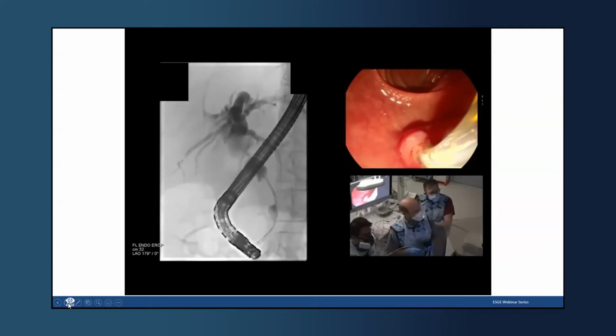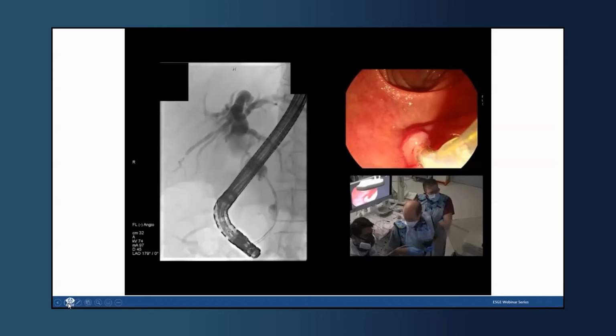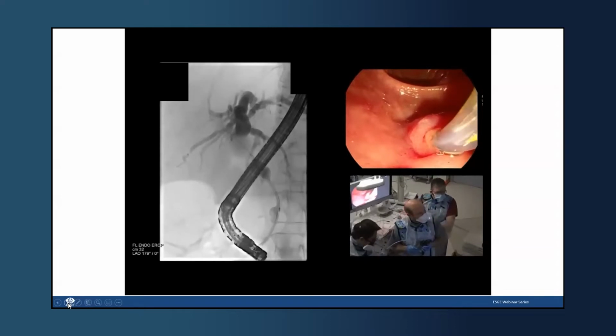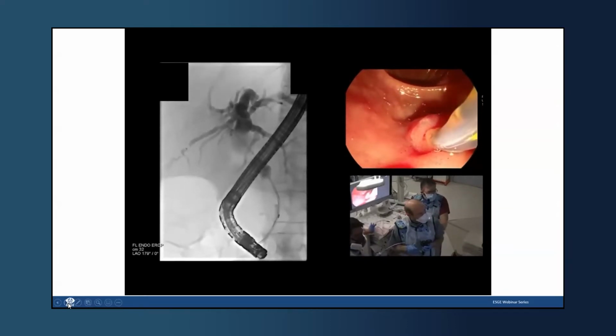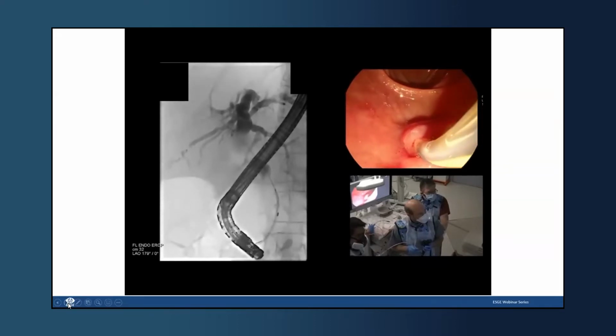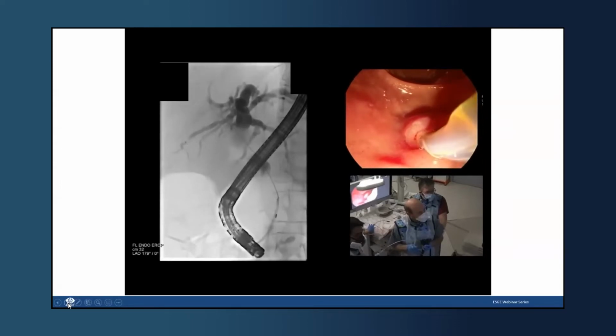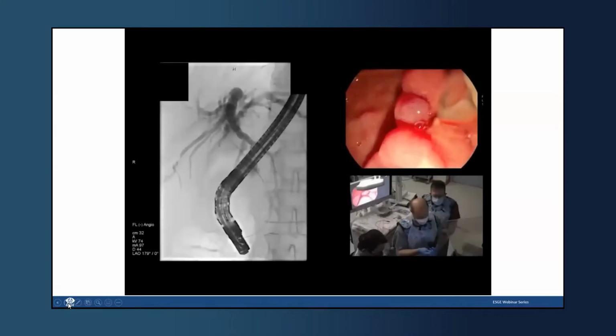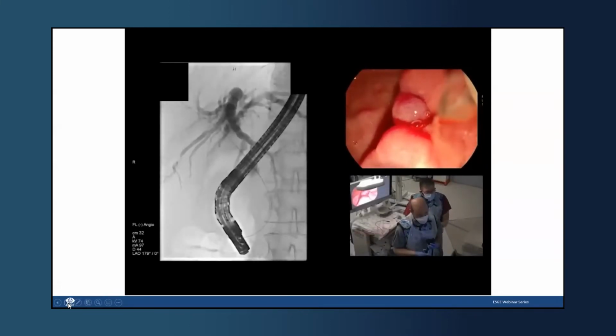So we're using the Infinity brush supplied by Steris, which we'll look at in the workshop. The advantage of this brush is that it has stiff bristles, front and back, and then soft bristles in the middle. So there's quite a shouldered stricture here.